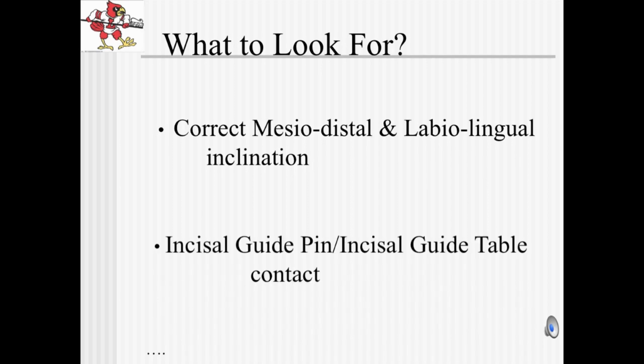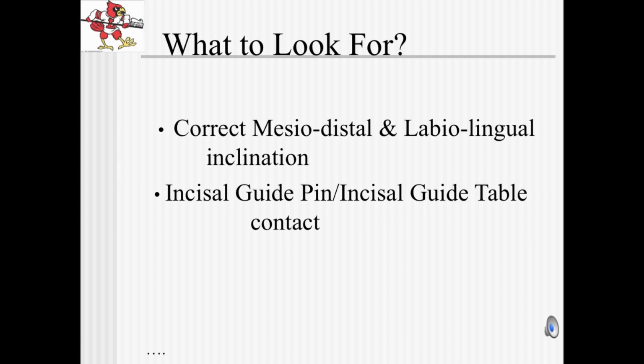The incisal guide pin and the incisal guide table must contact when we're setting teeth. And we will be looking for kissing contacts when the teeth are placed in protrusion. Also, the symmetry of the arch.